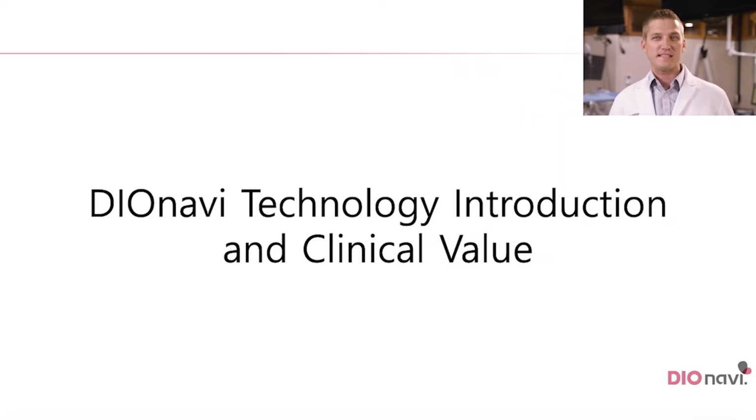So first topic, DIOnavi technology introduction and clinical value. I'm excited to talk about this with you as I've had a lot of experience working with other dental implant companies, dental implant guide companies, different laboratories, and I've seen what's out there, which makes what I'm about to share with you even more meaningful to me and in my practice, because it really is a level above the competition. Let's go ahead and get started.